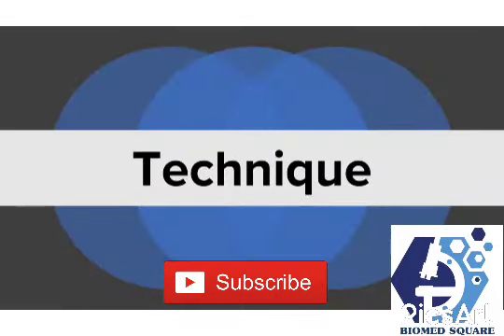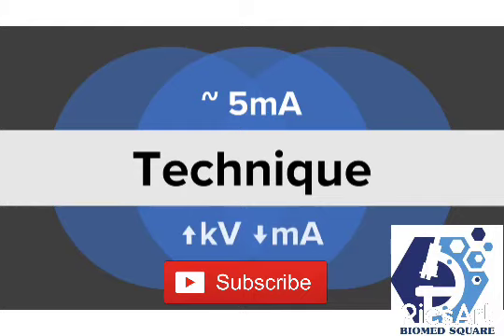On average, the MA is set to 5. Brightness is dependent on the anatomy being imaged, KV, and MA. A high KV and low MA are preferred due to the considerable increase in patient dose because of the continuous exposure.